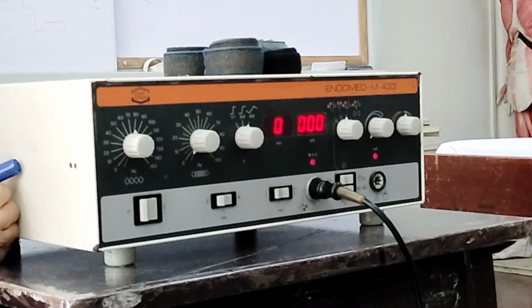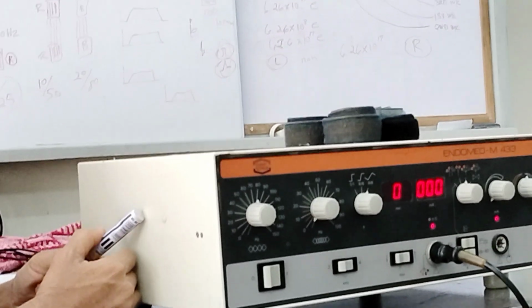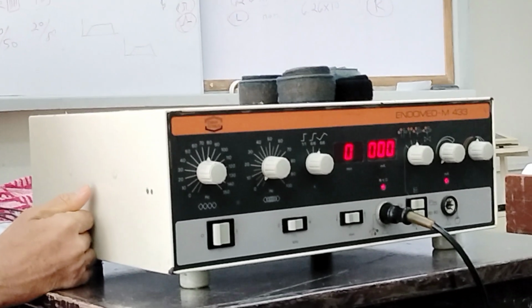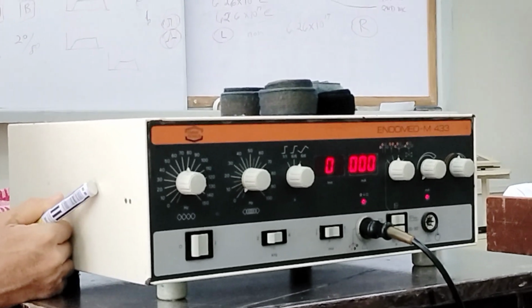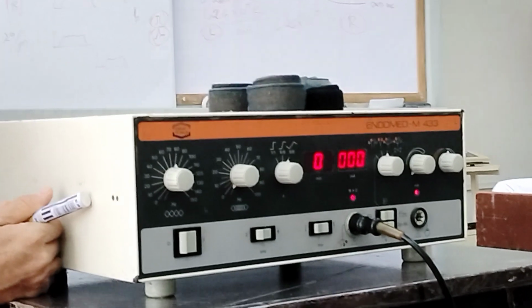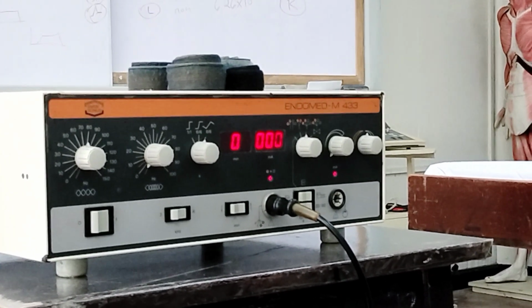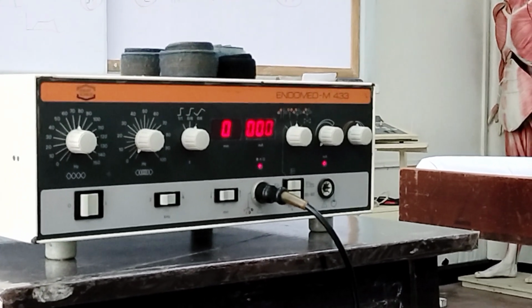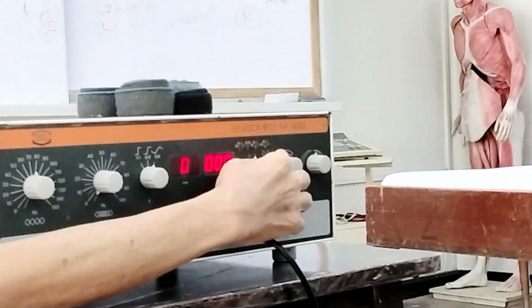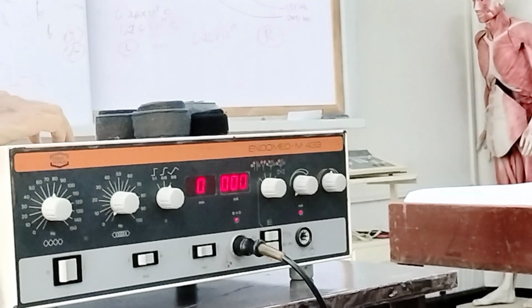But the advantage of quadrupolar is that there is less strain on the skin underneath the electrode, because it produces only one medium frequency current at the electrode. So it just measures that state. Okay? Next, on the rightmost, this is the quadrupolar four-pole method with vector scan.